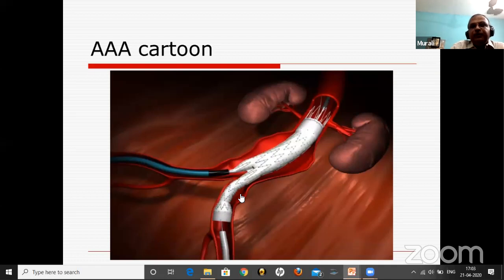So this is going to be common for any graft you use, whether you use the Medtronic or the Cook or the Anaconda. It's all just the common things. Maybe you have a 3-piece system in Cook. The newer Medtronic ones are also going to come with a 3-piece device. Otherwise, the conventional Medtronic device is a 2-piece system. So you have to know which one you are using and do it.